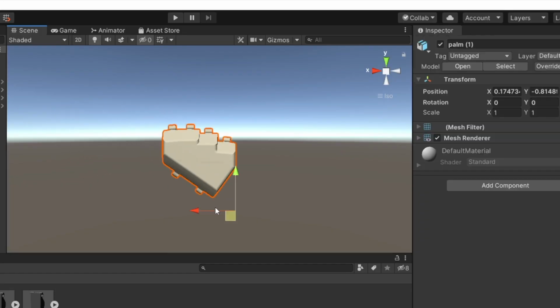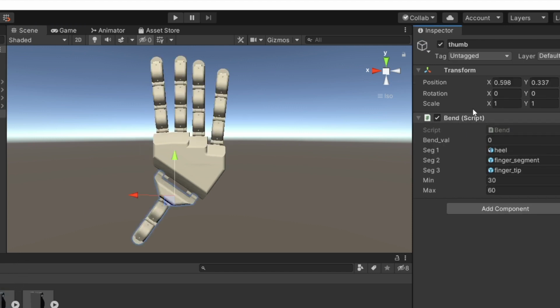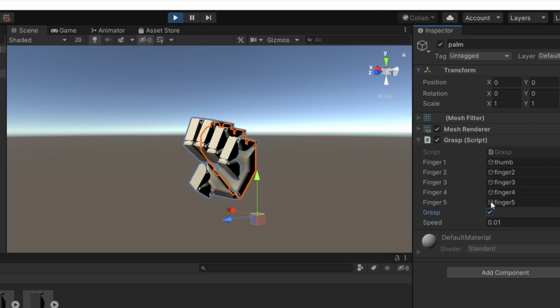I'll import the 3D models into Unity so we can model the hand dynamically with some C# scripts. I'll drag the components into the scene and arrange them as designed. I can add a few scripts to the fingers and palms so that the hand opens and closes with a single command. And we can even adjust the speed.